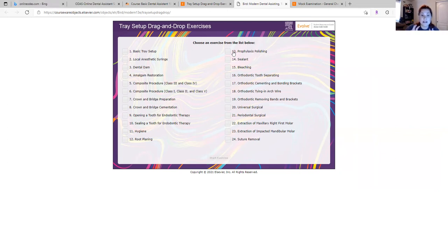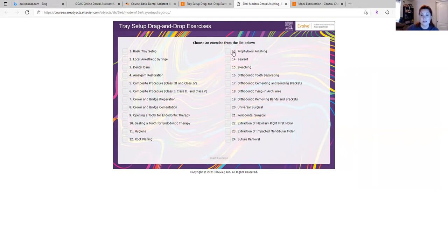But this is so great to learn what the instruments are called and also just what they look like and what is in that setup.